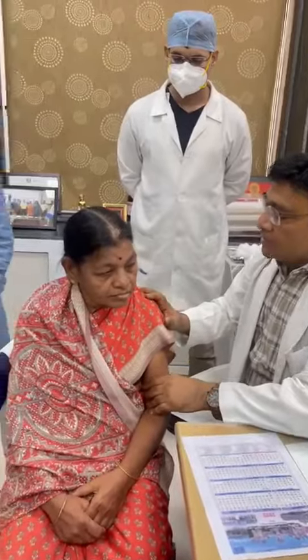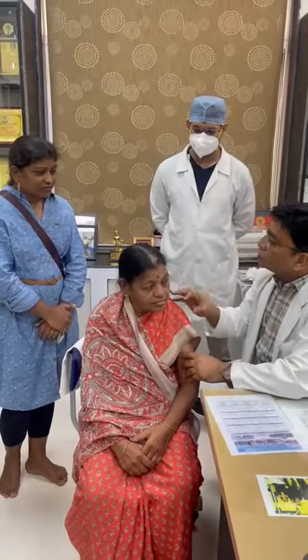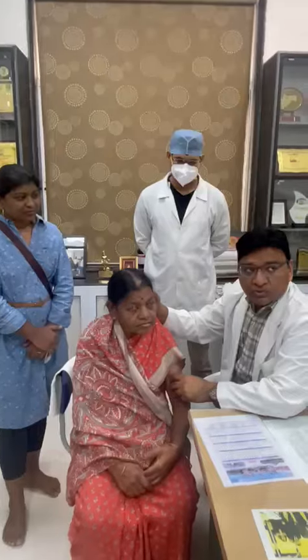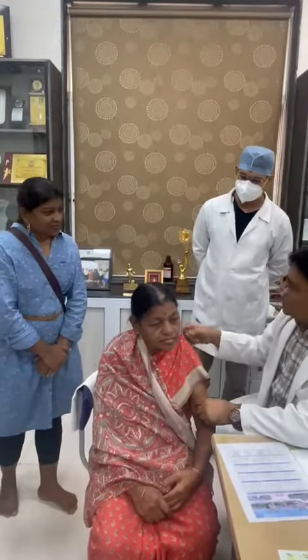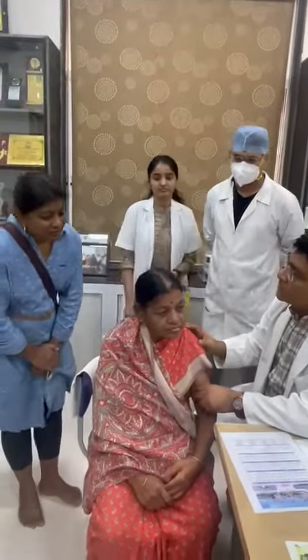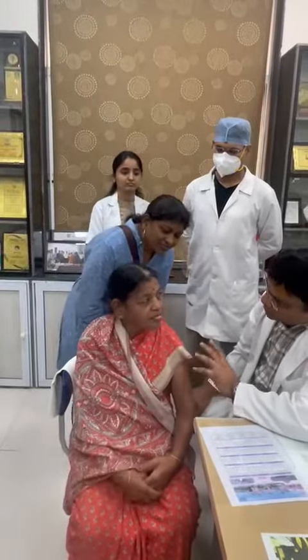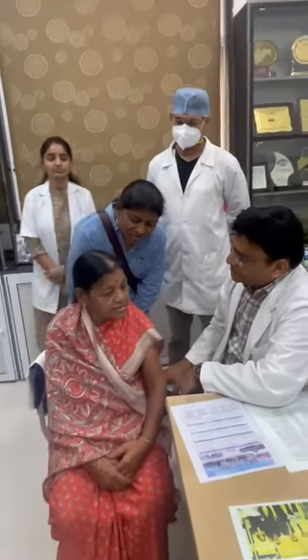You are her daughter. So today she has been switched on. She was implanted on June 1st and we have switched on after 15 days. So how are you going to feel it? How are you going to hear?